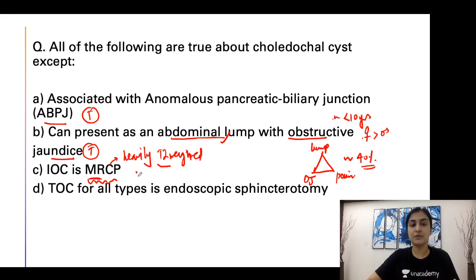The other option we always have will be ERCP, which is endoscopic retrograde cholangiopancreatography, where we put in an endoscope and inject contrast. It is retrograde, which means that I will be cannulating the papilla and injecting contrast such that the bile duct and the pancreatic duct get opacified. Remember, this involves X-ray. This involves fluoroscopy, which is a continuous video of X-rays. It involves the use of iodinated contrast and it is invasive.